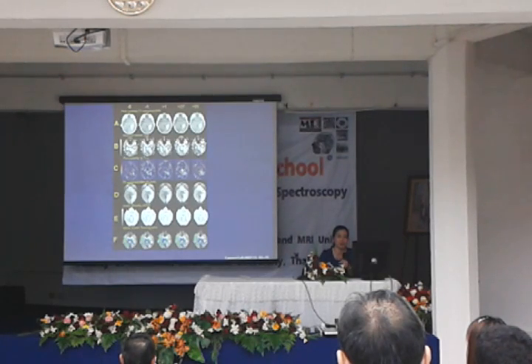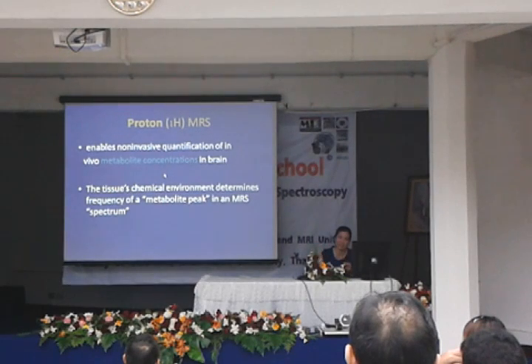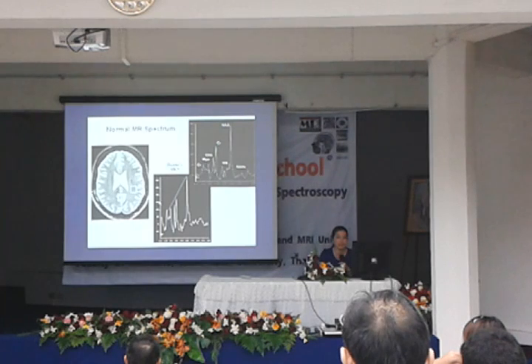After we know about post-treatment change, right now we need to follow up the imaging in high-grade brain tumor with a package of advanced imaging, more than conventional imaging. And go forward to MR spectroscopy, which we already learned in the earlier lecture, where we can measure the metabolic concentration in the brain. With this technique, we can get the spectrum of many kinds of metabolites in the brain.